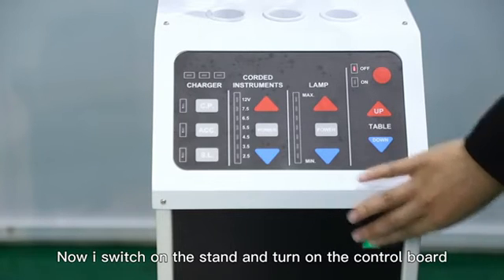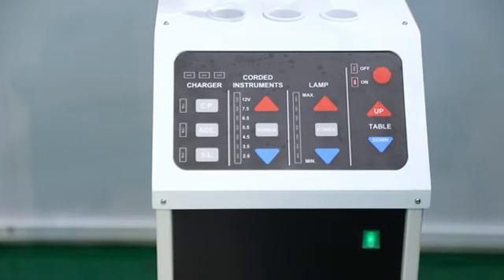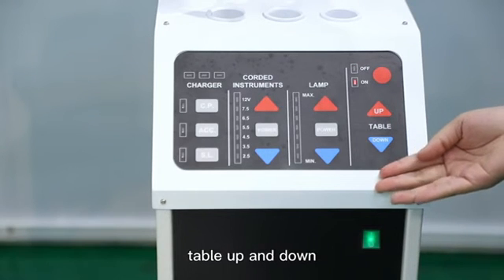Now I switch on the stand and turn on the control board. There are four areas. The first is to control the table up and down.